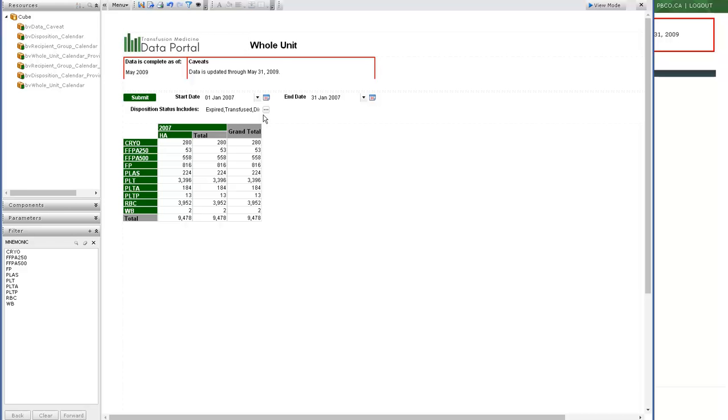But if we were filtering on a long list, and particularly in a long time frame, this filter panel may take a while to populate. There's no indication that the system is thinking. You have to trust yourself that you clicked the right button and just be patient for a few minutes while we wait for the filters to appear.